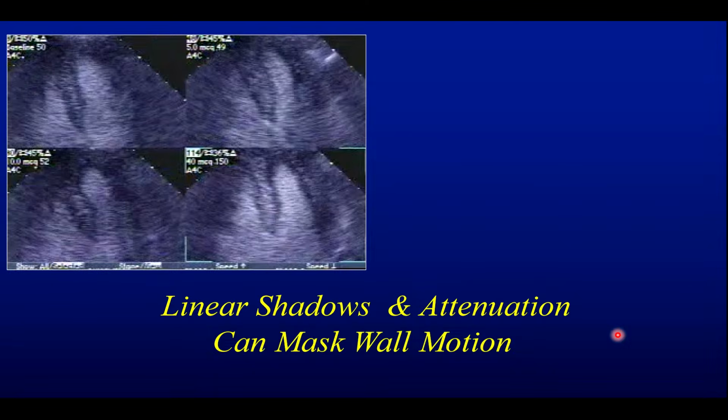When you use contrast with exercise, treadmill, okay, that's the most challenging, is exercise treadmill if you're going to use contrast. Use it at baseline, but you have to inject contrast and guesstimate about half a minute before they lie down, because you want the contrast to circulate. And if it is too much, you're just going to have to wait a little bit. Ideally, for contrast use with stress is either pharmacological or bicycle stress, where you could use it continuously. You have time to acquire, adjust the images, etc.